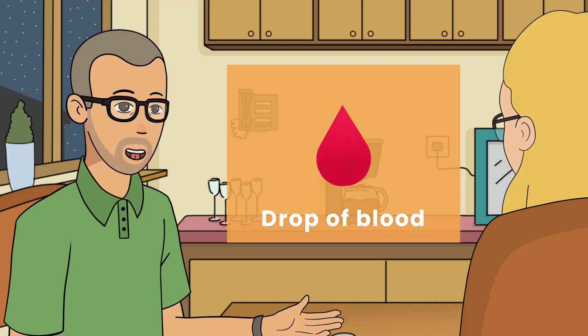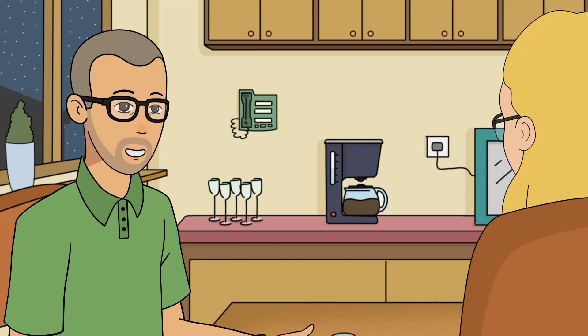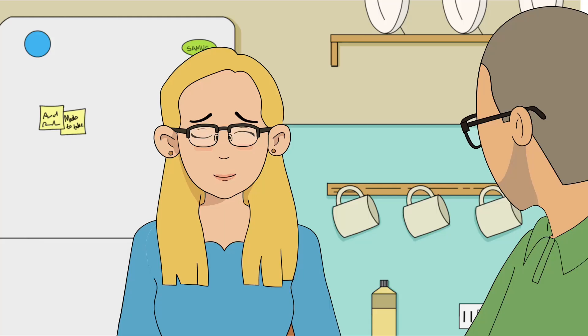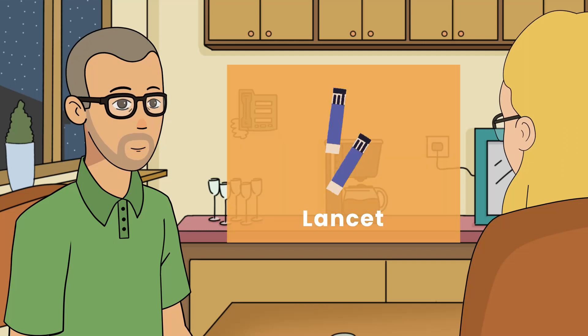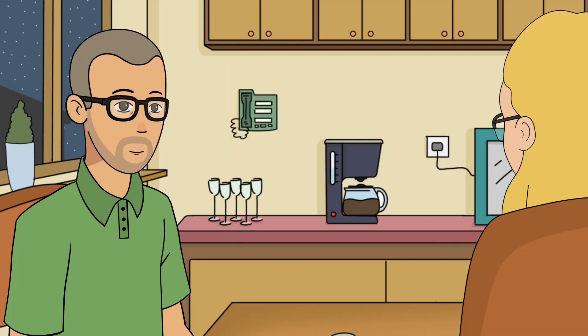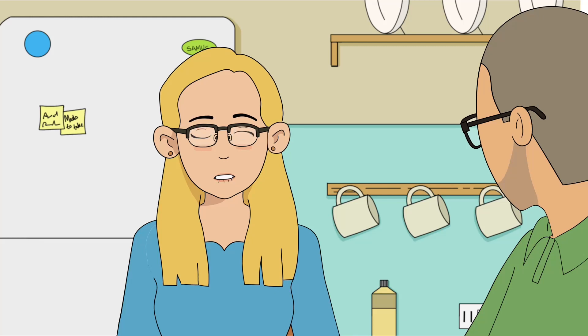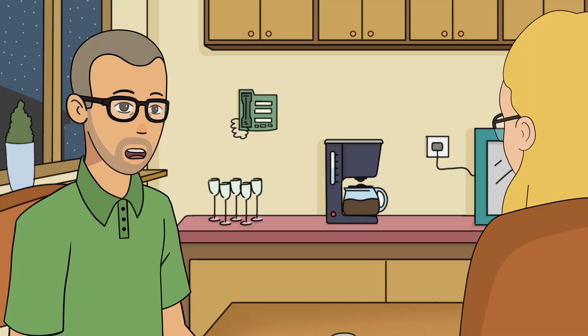And the machine will display the blood glucose level on the screen. So how do you get the blood? Do we draw it using a syringe? Oh no, no, it is much simpler than that. We use a lancet for pin prick that you buy separately. A lancet is somewhat like a needle, right? Yeah, it's a needle used to prick the finger.